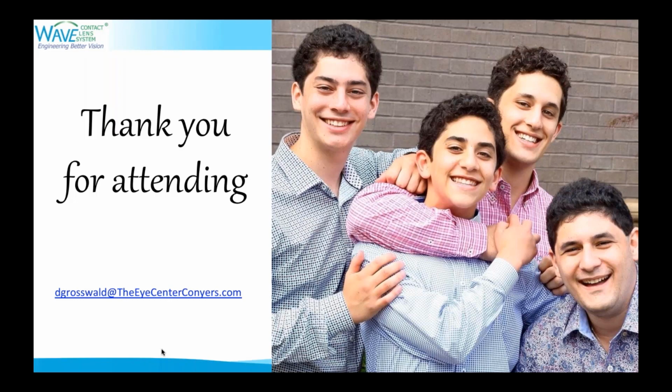So I do put a diagnostic lens on all my irregular corneas to get the best possible power outcome at the first visit. It's a wow factor. You'll see your patients cry. I think it's great for practice management, is my point. If someone's got a 20/20 endpoint, then the WAVE software is incredibly accurate at nailing that refraction, so it's not needed. Okay. So I guess we have time for one more, and I'll finish with a really easy one.